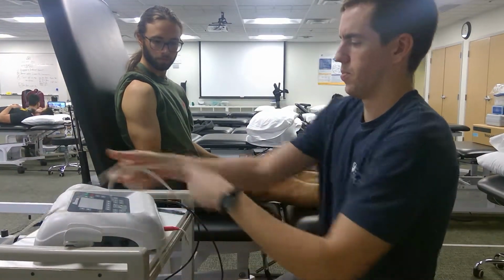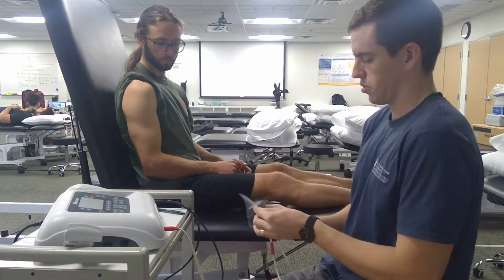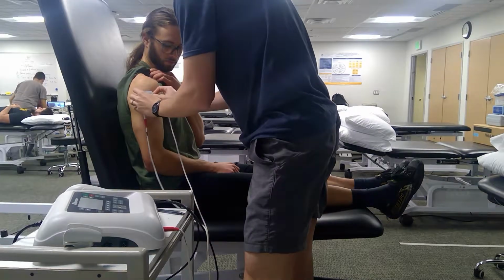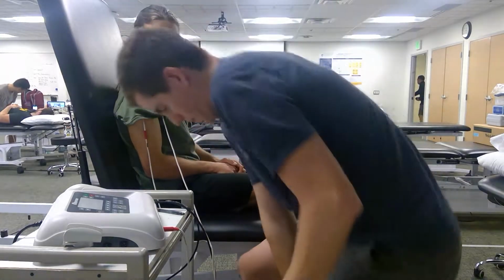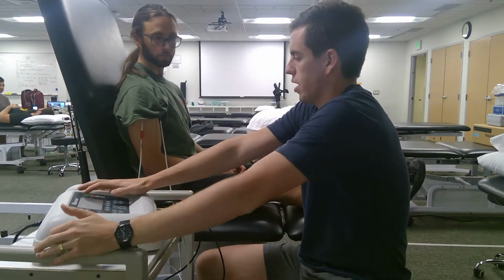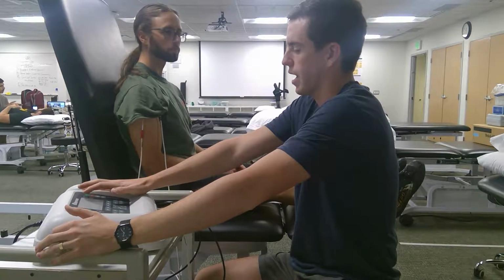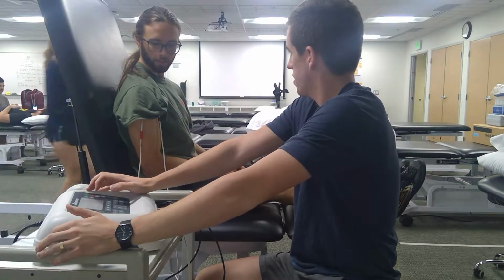So we're going to come up and we're going to take the electrical stim pads and place them on Greg's shoulder here across that joint line. Make sure those are good and secure. And then we're going to go ahead and come in here. All right, Greg, I just want you to tell me when you have a comfortably light tingling sensation of the area between those two pads. Okay. You starting to feel it there?